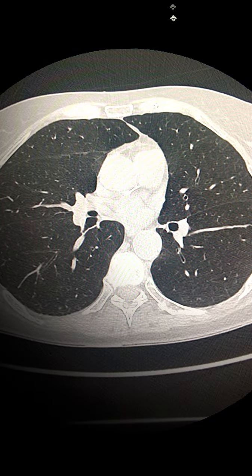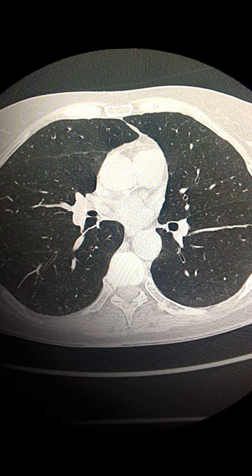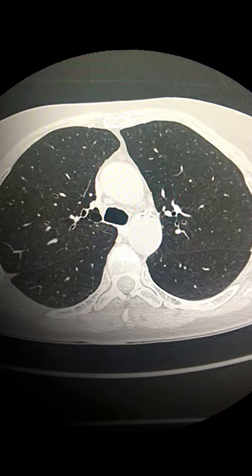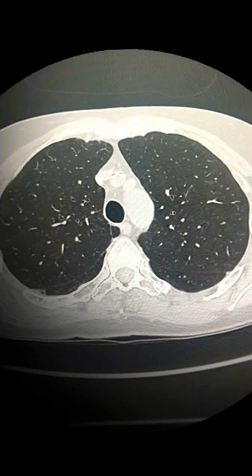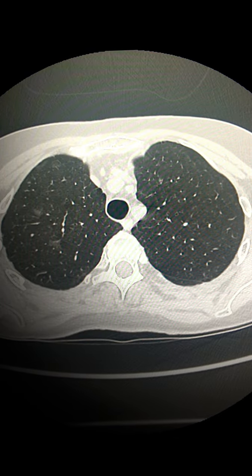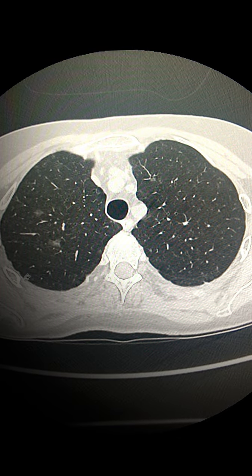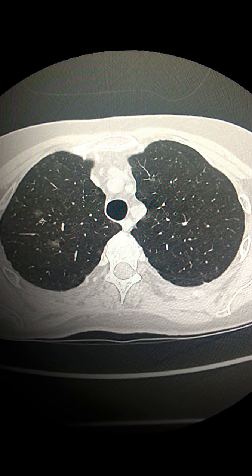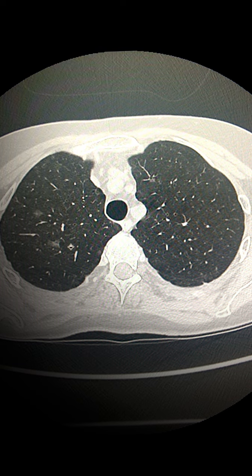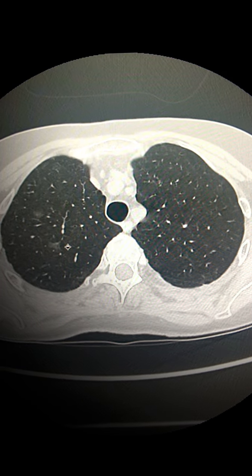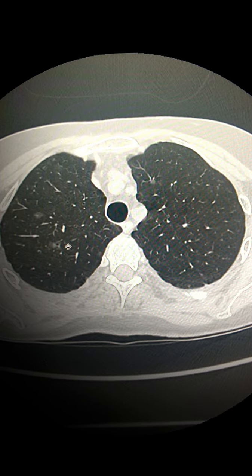The definition of ground glass means that the lung markings can be seen through this increased density area. The next step is to evaluate whether there is a solid component or not.